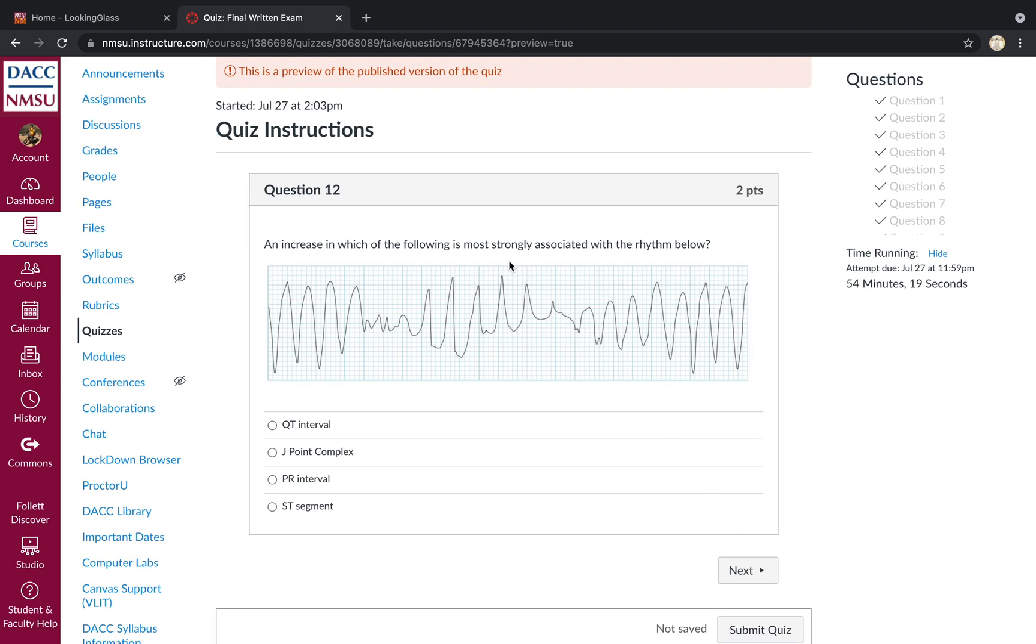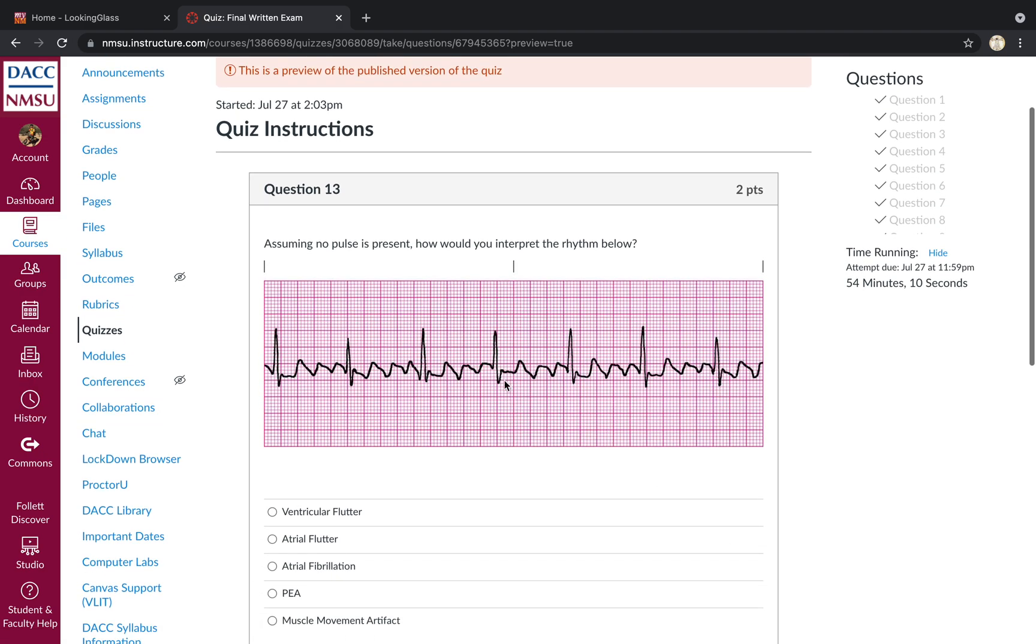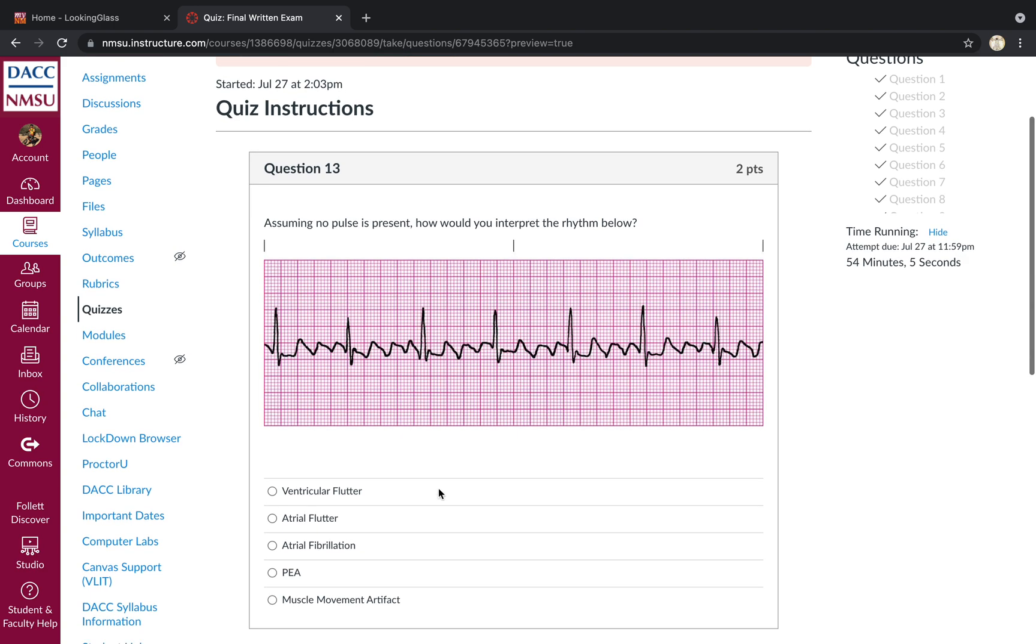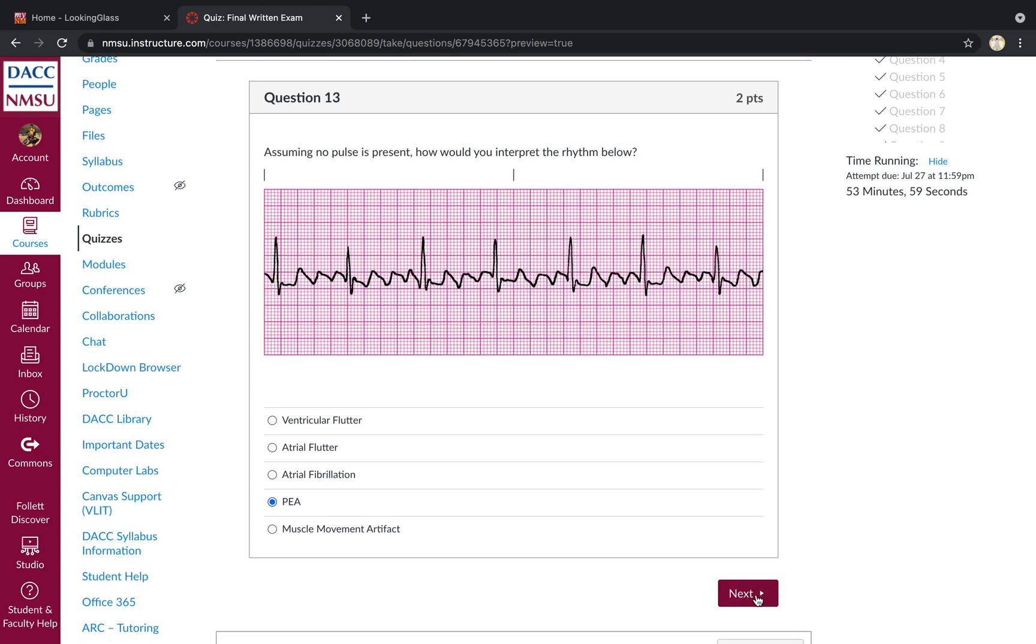An increase of which of the following is strongly associated with the rhythm below? So this is torsade de pointe, QT interval prolongation would be the best answer there. Assuming no pulse is present, how would you interpret the rhythm below? No pulse is present. It's an organized rhythm that would make it pulseless electrical activity, not atrial flutter because there's no pulse. So we cannot call it atrial flutter.